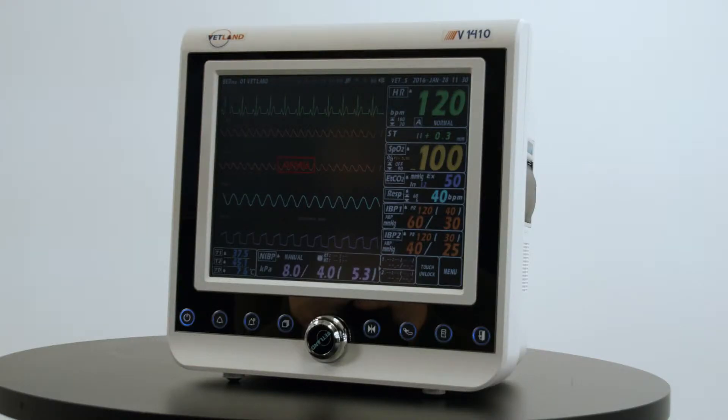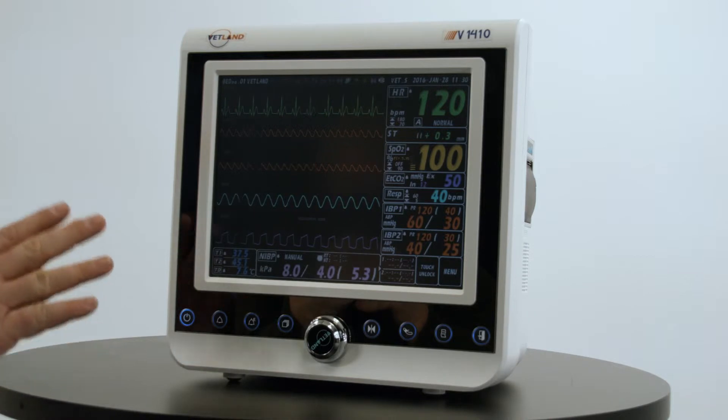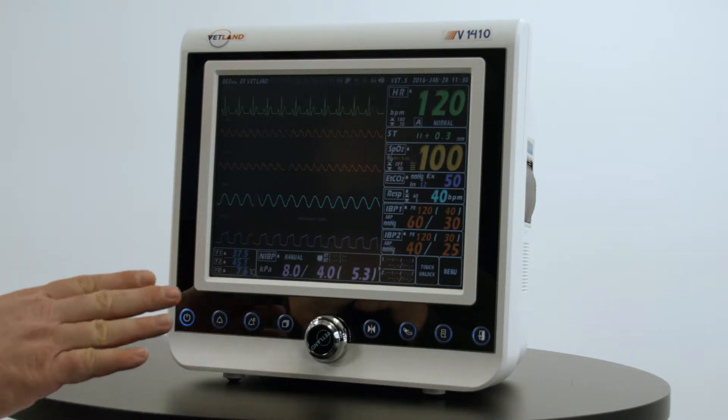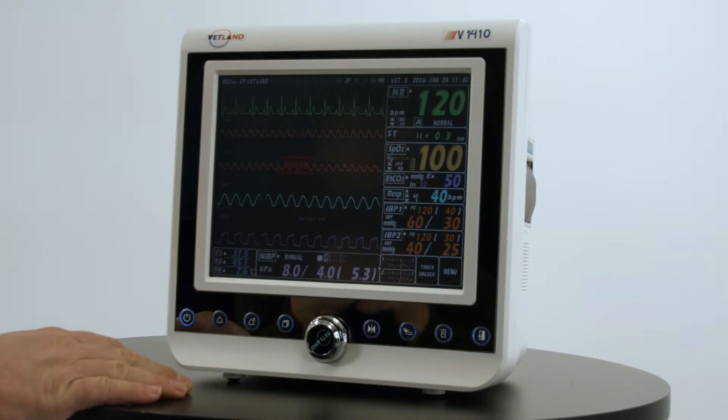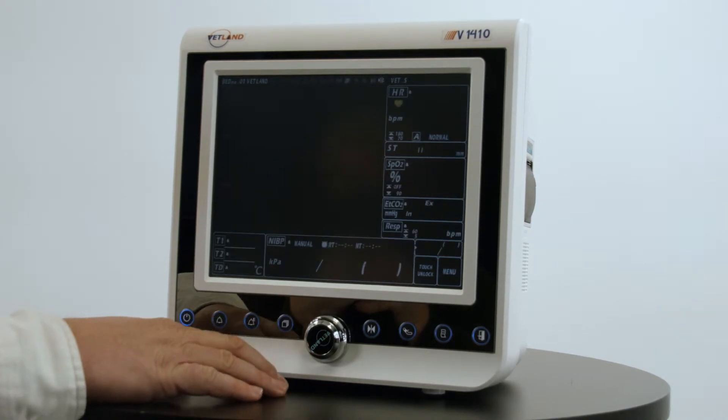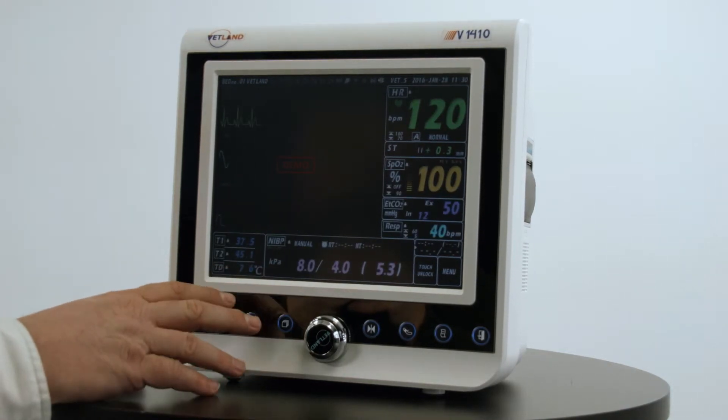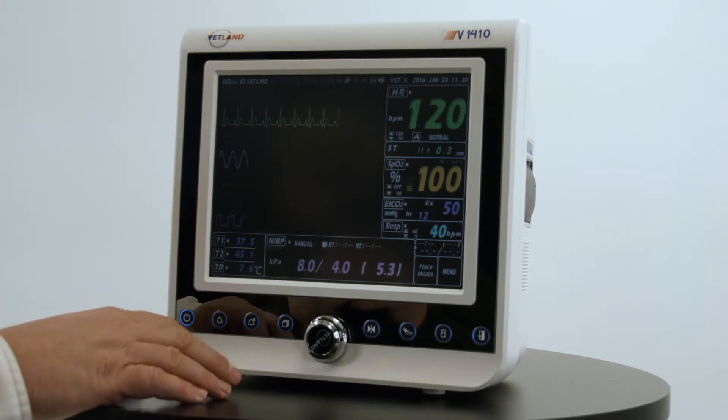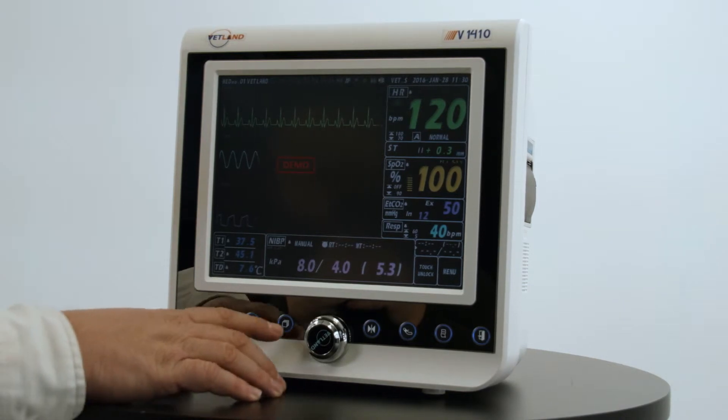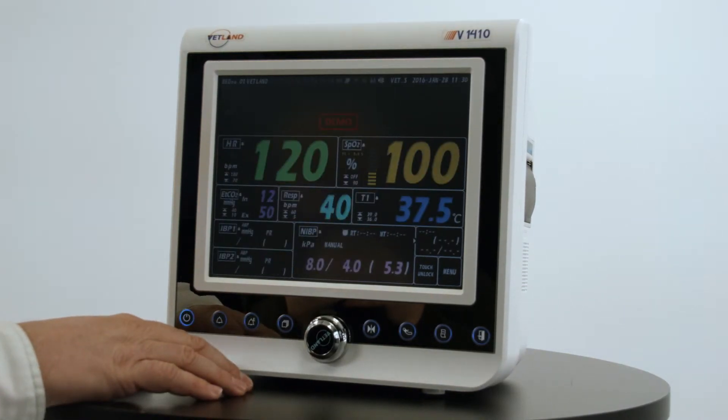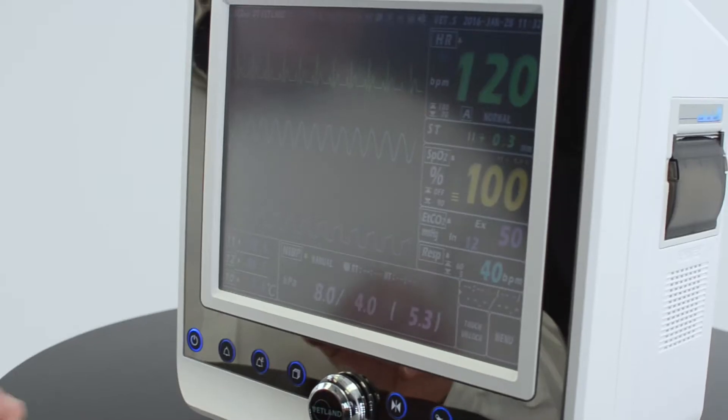The 1400 series monitors have six different display screens. This screen is the five wave display. We also have a reduced wave screen with just three waves and larger numerics, and we also have the large numeric screen with reduced wave area.